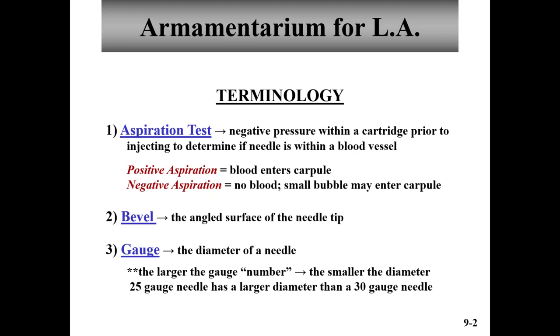I'm going to get you in 2 separate groups, and I'll pass out the syringes and the needles, and you'll actually be able to put a syringe together, look at the needle, look at the carpules, and load a syringe. We're going to have you do an aspiration test. So you'll actually get your hands on this armamentarium, on this equipment. It'll make a little more sense.